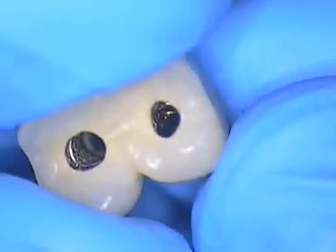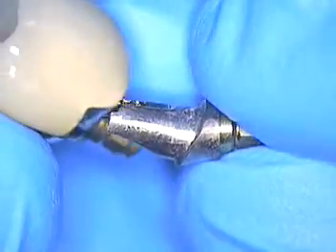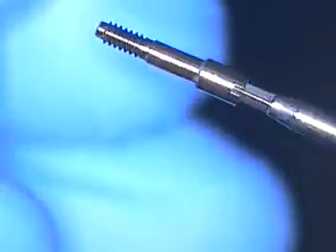We can then retrieve this next time and be able to go back in and do whatever else we can to make this case better. The type of screws that come into this are called standard abutment screws from Fryden. This is what they look like — internal hex — and you can also go with the flat head driver.